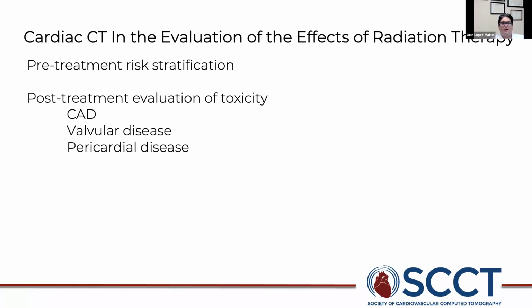In regards to cardiac CT in the evaluation of the effects of radiation therapy, it's important to keep in mind that these patients, before getting radiation treatment where the heart is in the treatment field, usually undergo a low resolution CT that is a treatment plan. If that's the only chest imaging available, which is unlikely, and a calcification is identified, that could be used to estimate the risk. However, high resolution non-contrast chest imaging should be considered to assess for coronary calcifications.